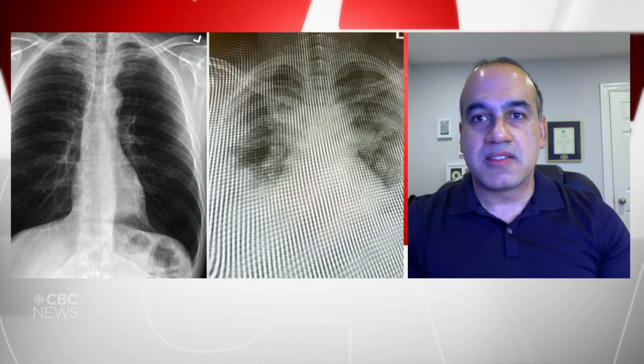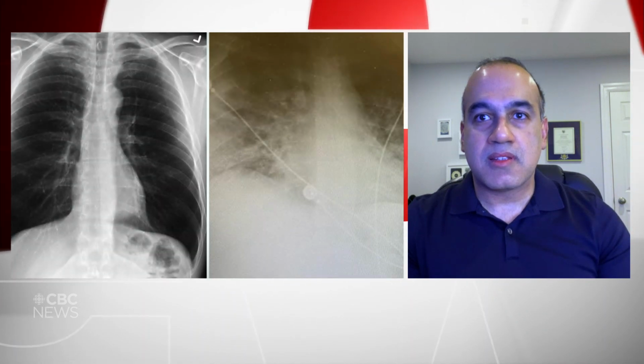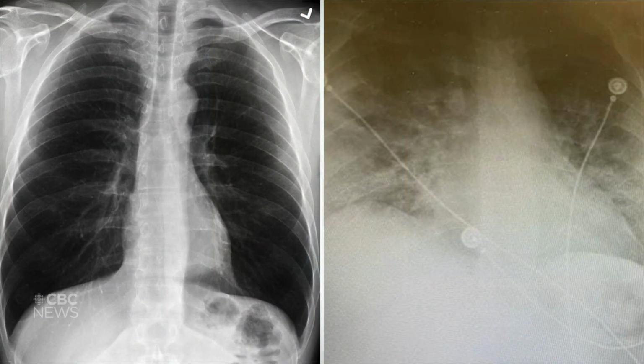Okay. Keep going with this. We have a 30-year-old patient now. This is a man. Here's our second slide. Again, look at this and tell us what we're seeing in this one. So same thing. You're seeing sort of a haze and white all over the chest, beside the heart on both sides. And again, this is fluid in the lung. It's viral pneumonia, and this person was also fairly ill. They were admitted for something else to the hospital. Then overnight, they had trouble breathing. And they did an X-ray and discovered this. They didn't even know they had COVID.